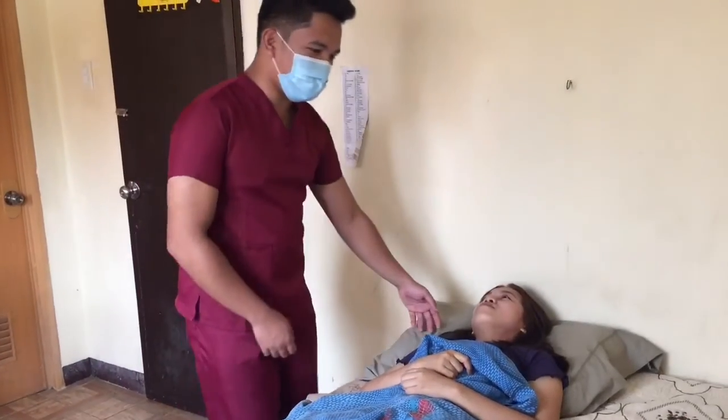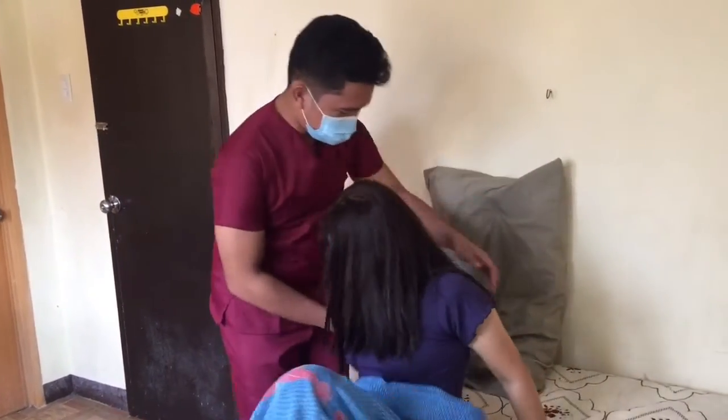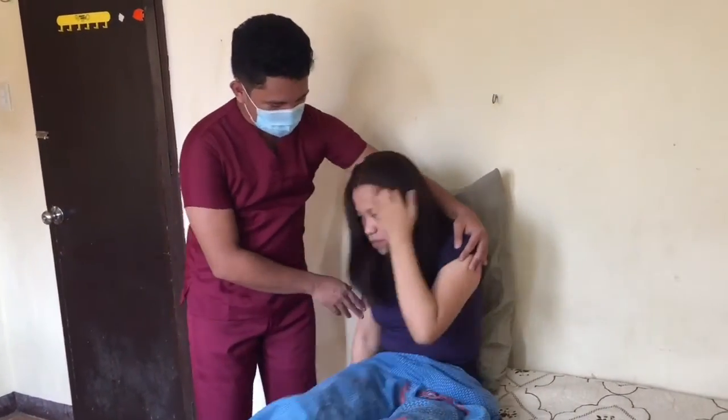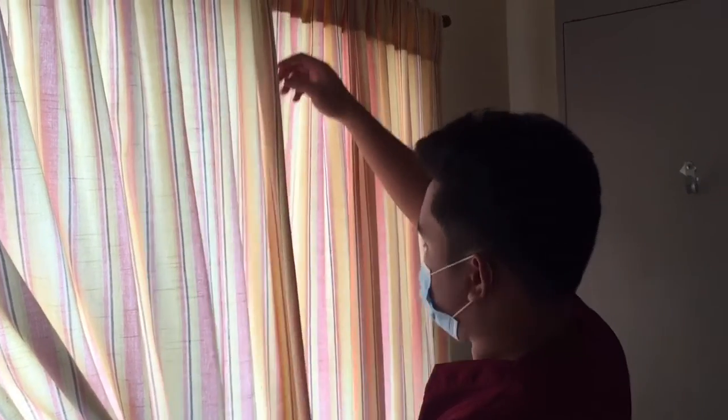So, prepare the client by assisting to semi-Fowler's position. Provide privacy to the client.